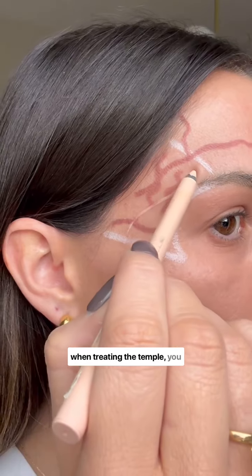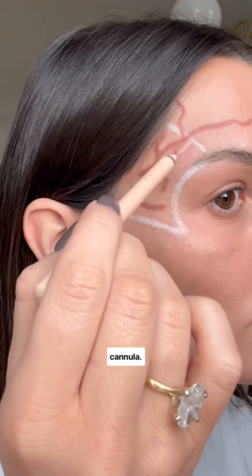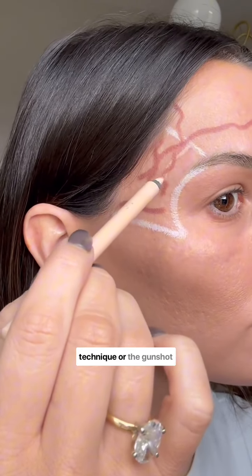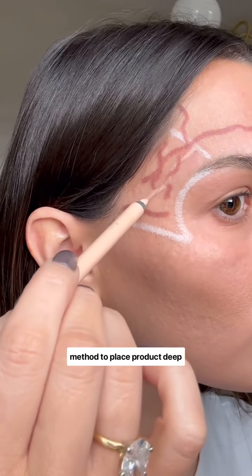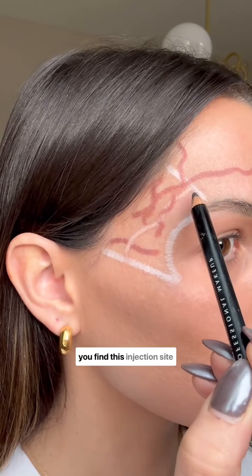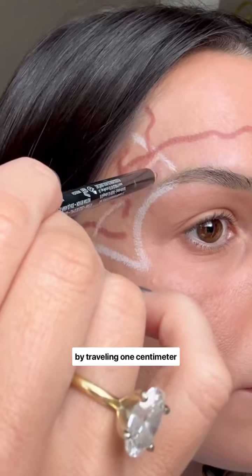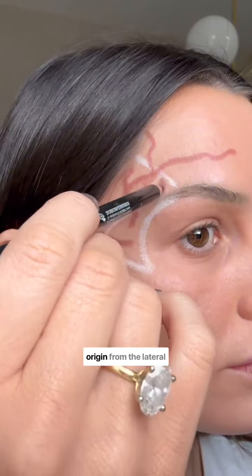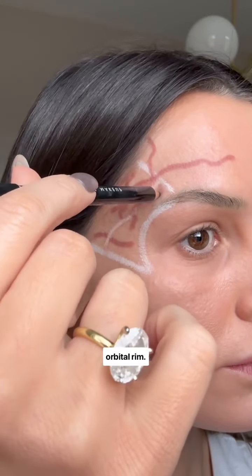When treating the temple, you can either use a needle or a cannula. If you're going to use a needle, you can use Arthur Swift's 1-up, 1-over technique or the gunshot method to place product deep on periosteum. You find this injection site by traveling 1 centimeter up and 1 centimeter lateral to the temporal fusion line's origin from the lateral orbital rim.